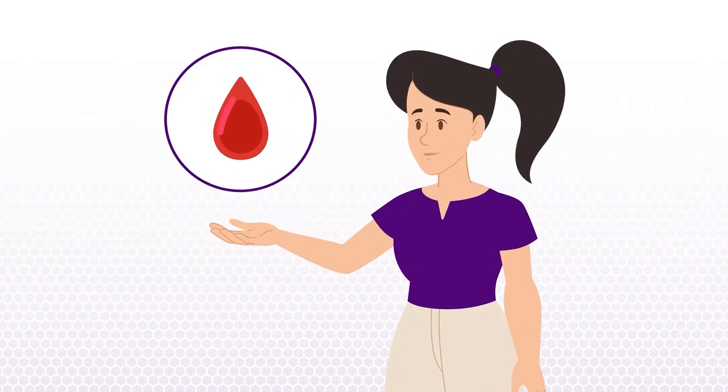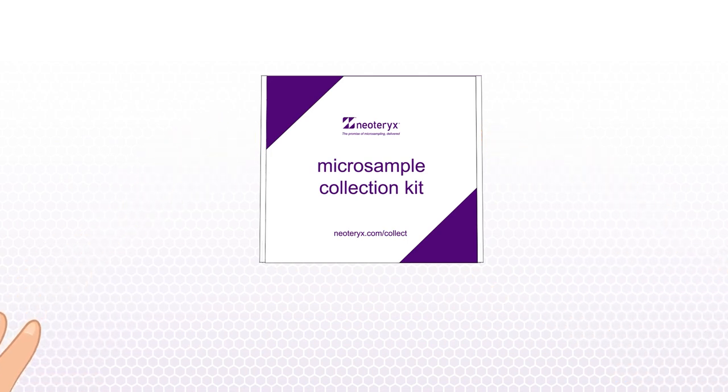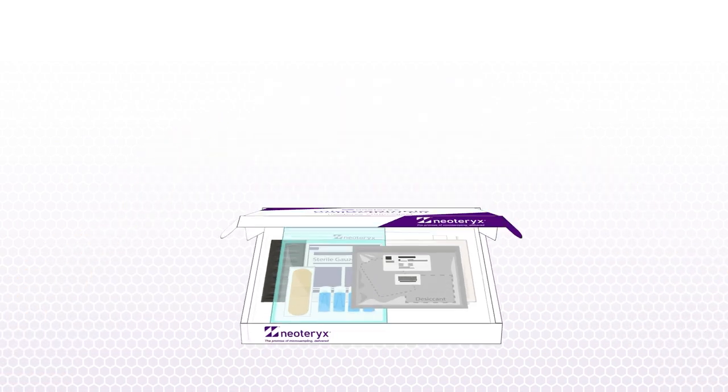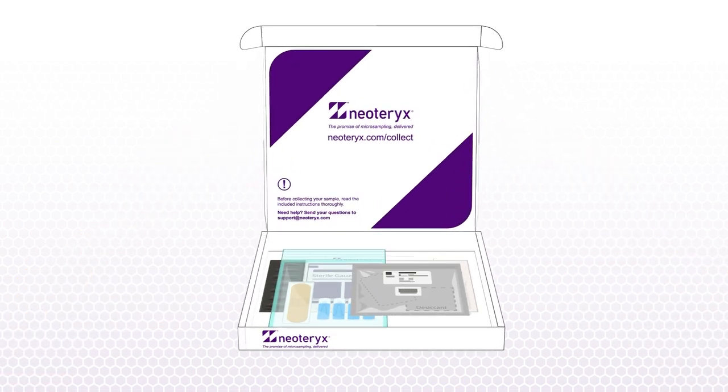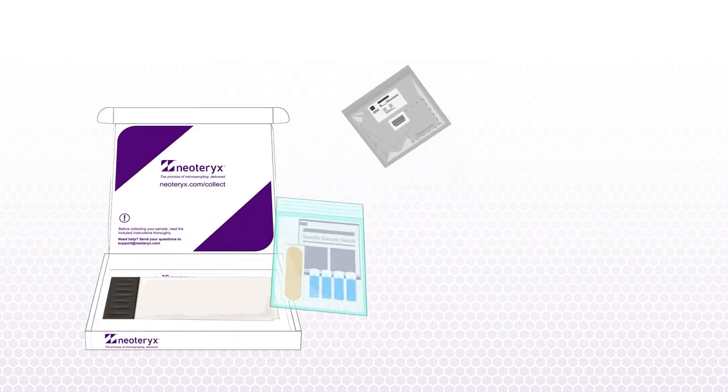So you need to collect a blood sample. Let's walk you through how to easily do that using the Mitra microsample collection kit with a quick and easy finger stick. Let's unpack the Mitra kit.